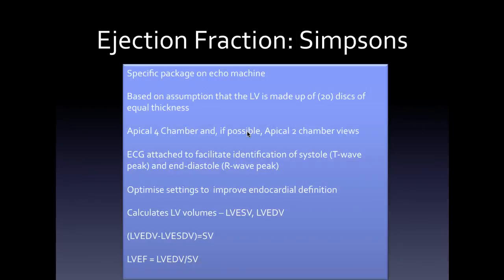Simpsons, actually, which I don't know why that slide jumped there. Simpsons is easy to remember because most of us watched the TV program for many years and still do. But again, core echo labs would tend to use Simpsons as a standard approach.